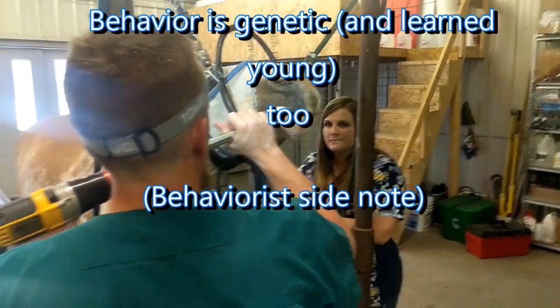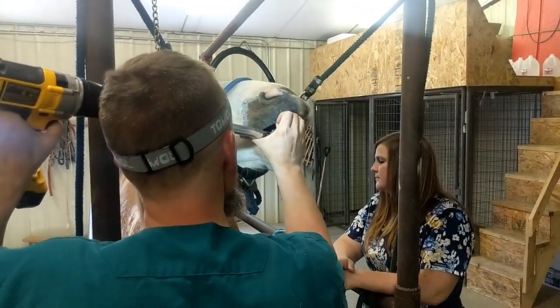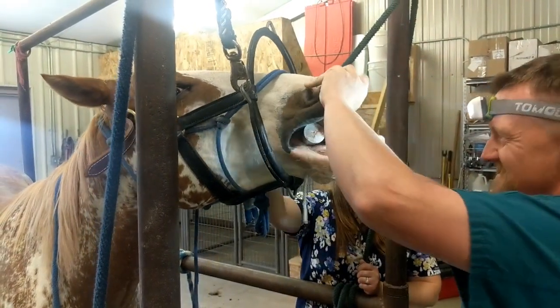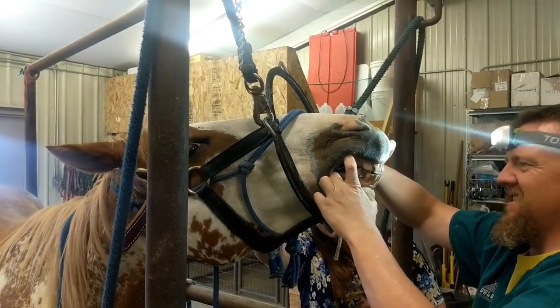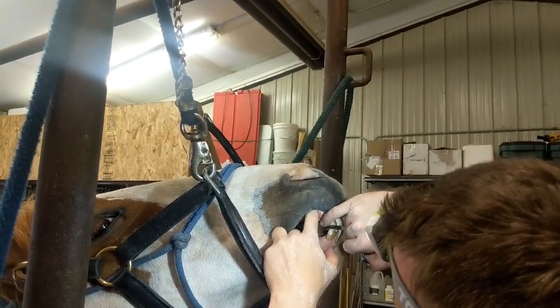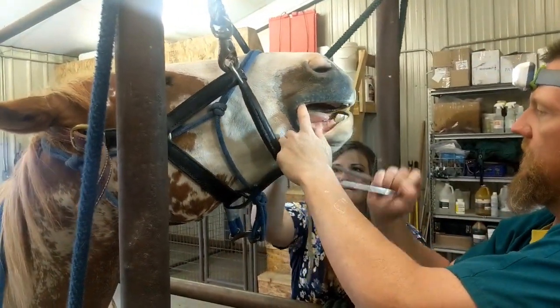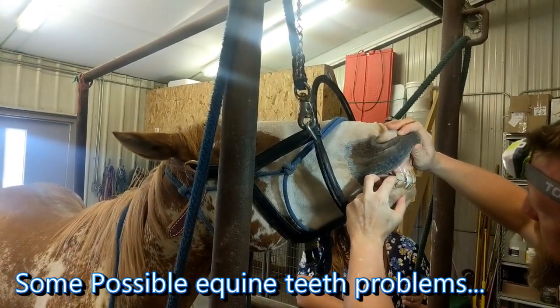That's a ten-year-old mouth. You can see how that tooth — it's called the caudal part of that tooth — hangs over the back of this one a little bit. That part's going to grow unchecked; there's nothing for it to grind against, and so that's why you get that little hook right there. I wouldn't even say it's abnormal for that pattern — for many horses, it's almost normal for them to sit back of that tooth.